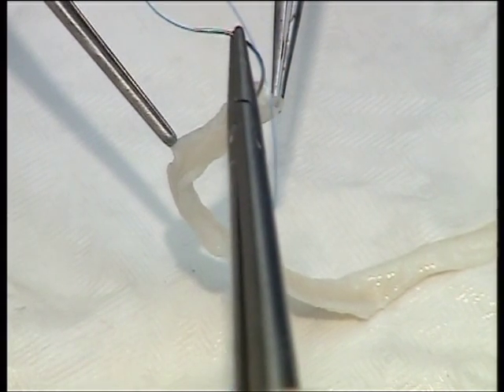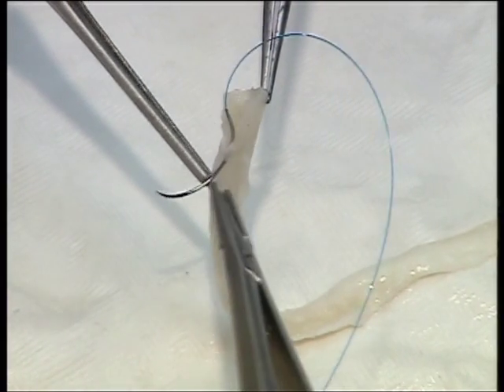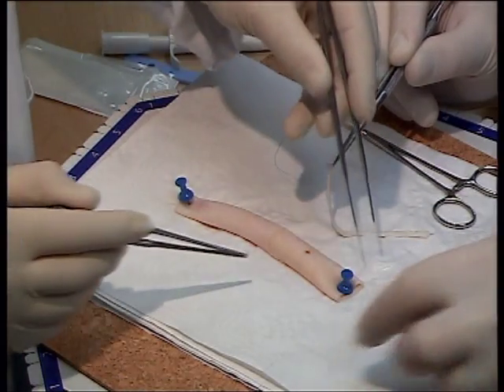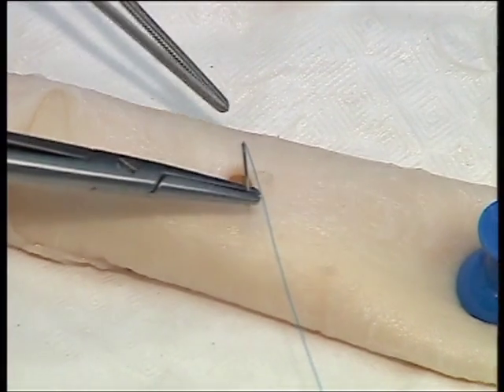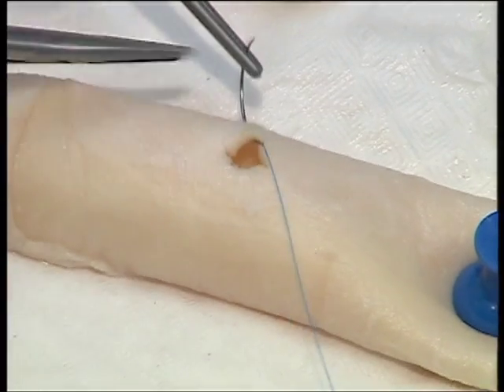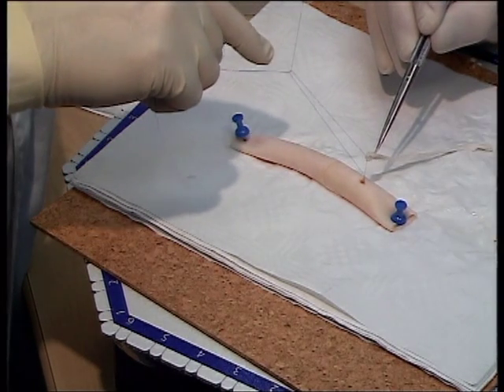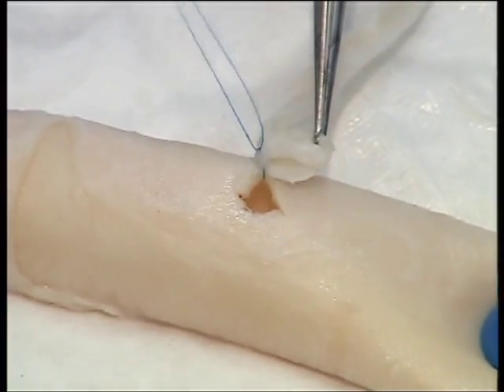Pass the first arm of a 5-0 proline suture through the heel of the conduit and put to one side. Take the other arm and pass it through the aorta from inside to outside at the 12 o'clock position, as if you were looking at a clock face. Now lower the conduit onto the aorta and secure in position with 3 throws of a knot.